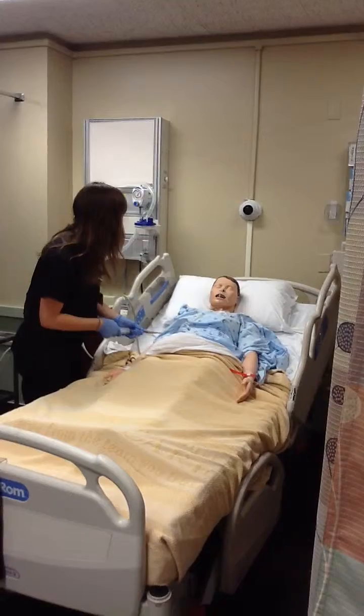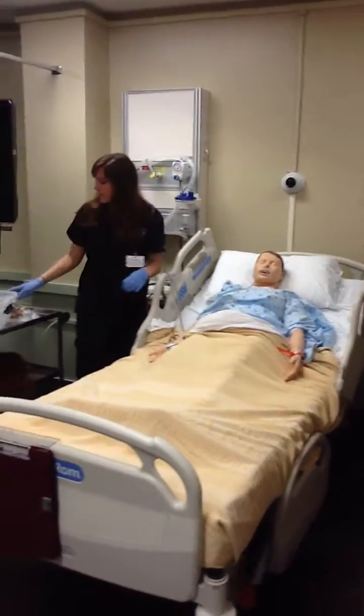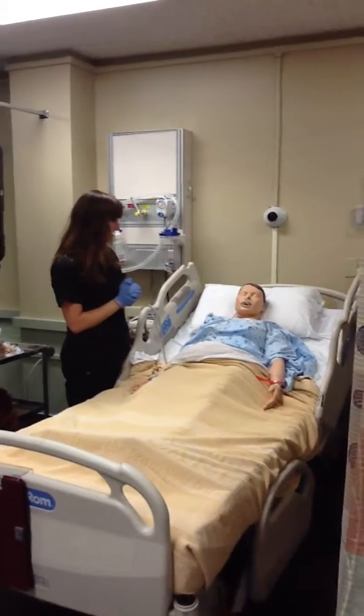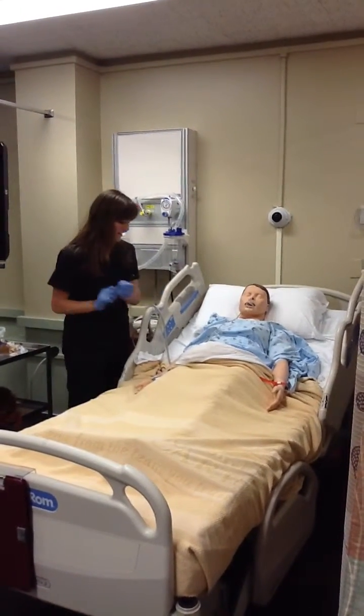All right, and the last thing we're going to do is we're going to have an x-ray for you. We're going to take you down there just to reassure us that we did get it in the right spot. Do you have any questions? Do you feel okay? All right, thanks, Mr. Monroe.